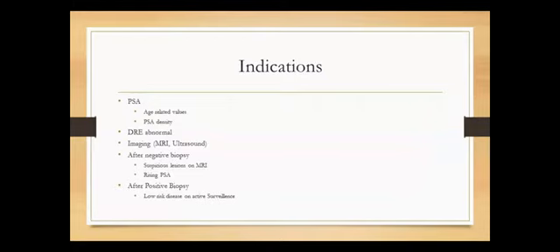So indications for prostate biopsy: age-related PSA values, PSA density which is higher than expected, and an abnormal DRE. We also recommend prostate biopsy on imaging, if you find any lesion that is suspicious for malignancy on MRI or ultrasound, then we advocate for biopsy.